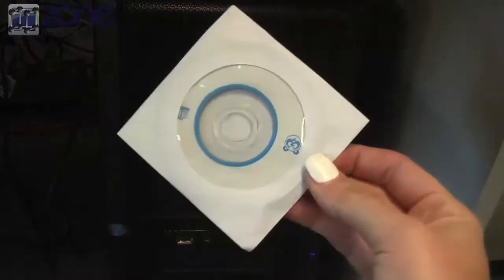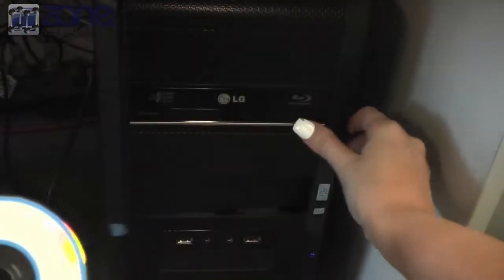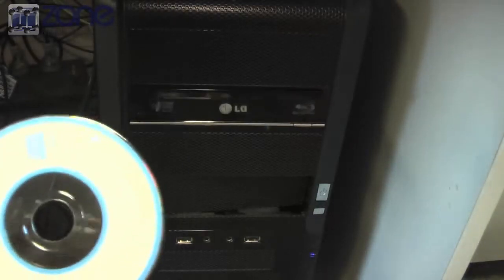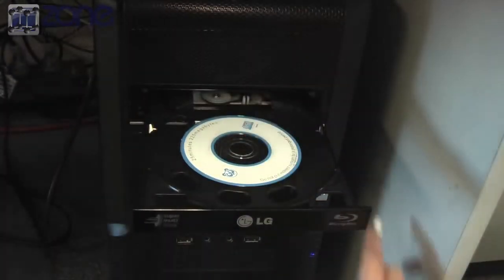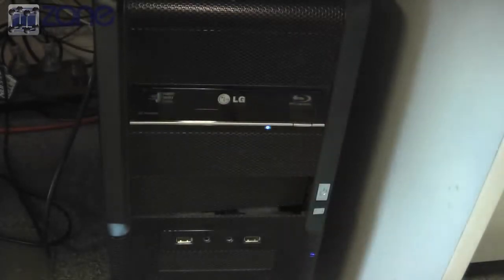To install the software and get started with your ECG Mac, you'll need to place the disk into your CD-ROM. The software does require either Windows XP, Vista, or Windows 7 or 8.